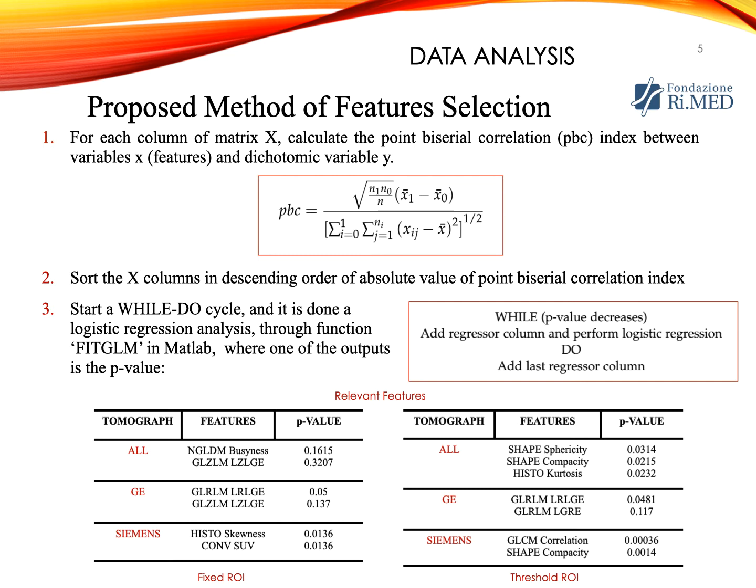so a new strategy is implemented using the point biserial correlation, which calculates the correlation between the single feature and the dichotomous gold standard, in this case 0 and 1. Based on this value, the features are sorted from the highest to the lowest point biserial correlation.